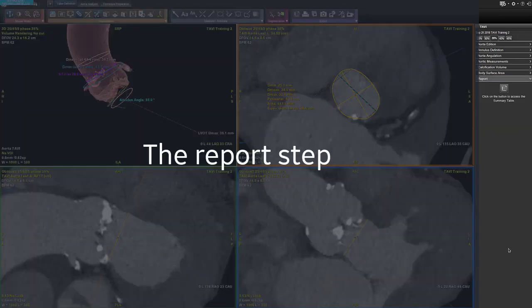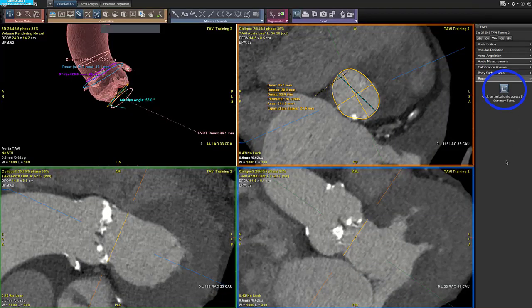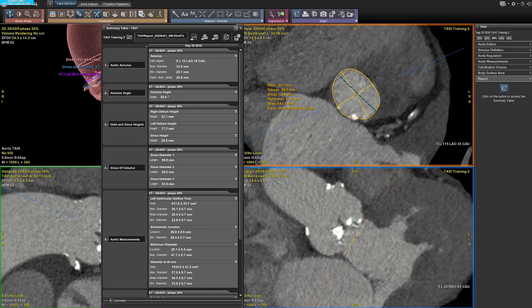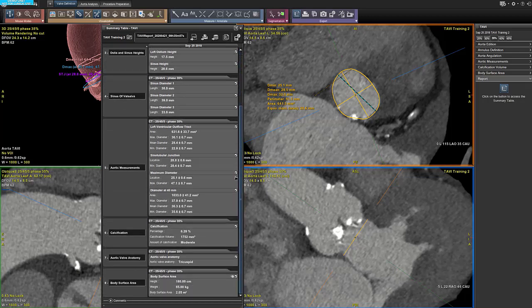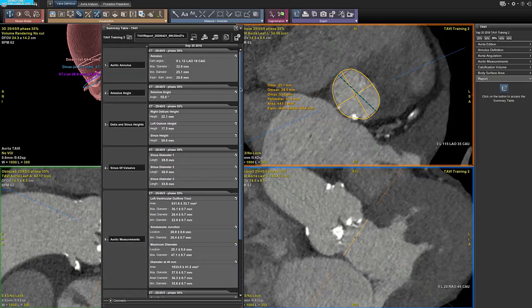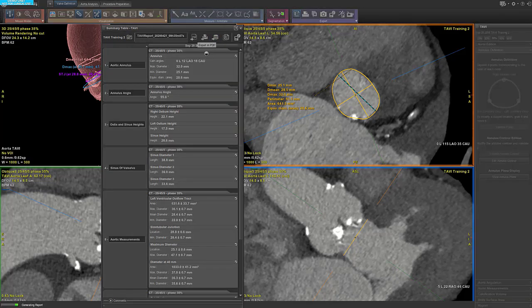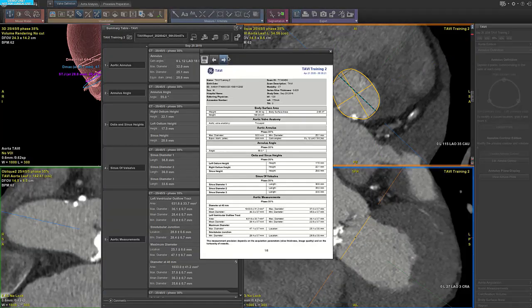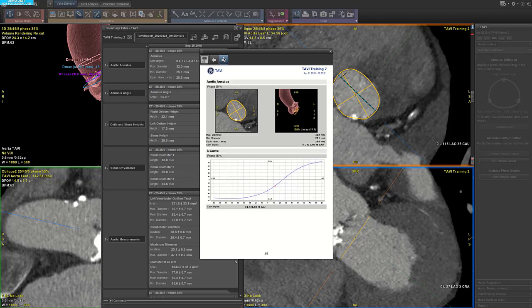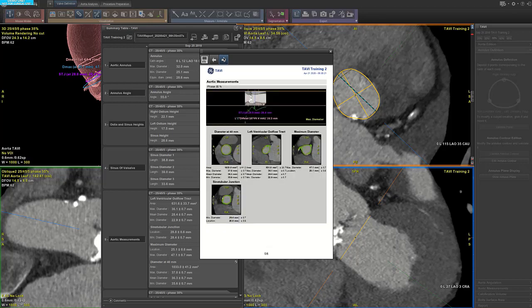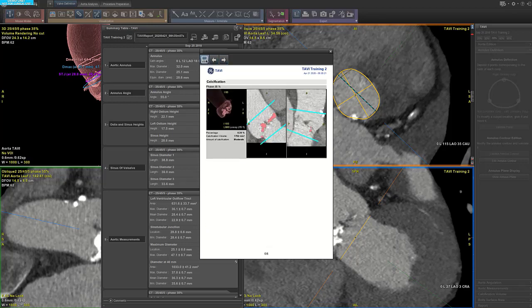We can move on to the report step. You can click on the icon to open the summary table. All the measurements are gathered in the summary table. You can create a report in PDF to the viewer or export to database. You get a report of several pages in PDF. You will retrieve all the measurements that were performed, as well as images. You can save and send the report if needed.